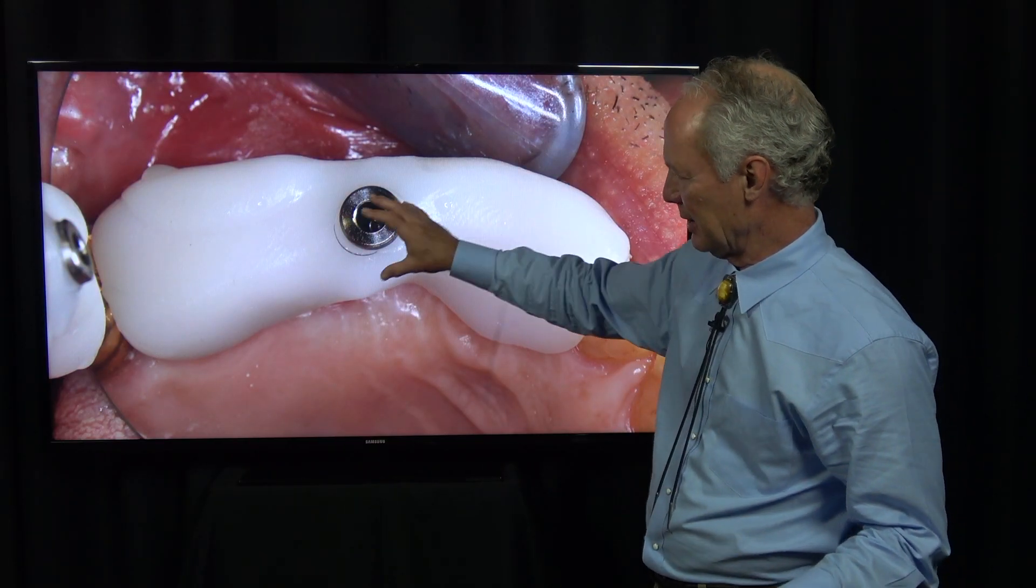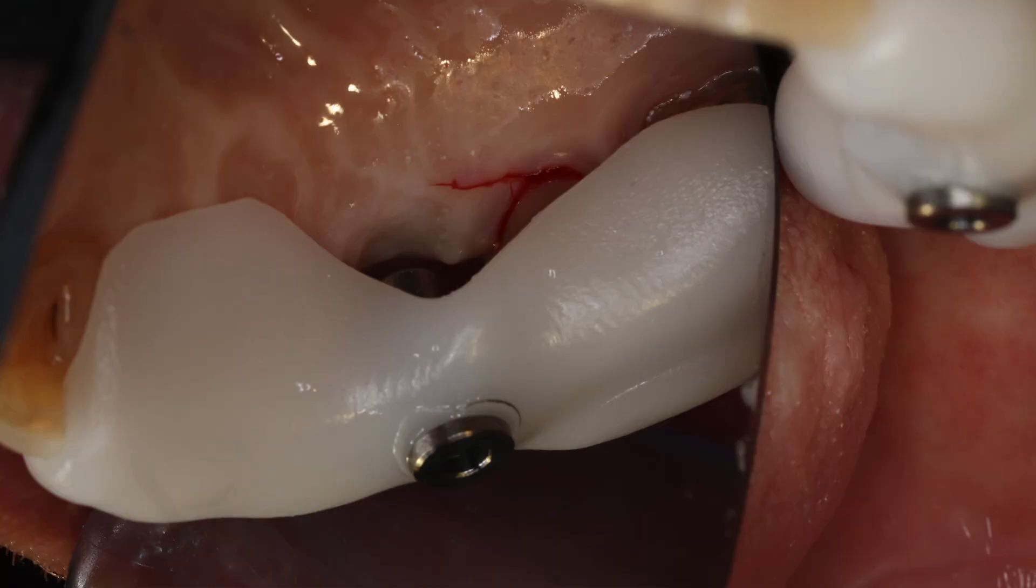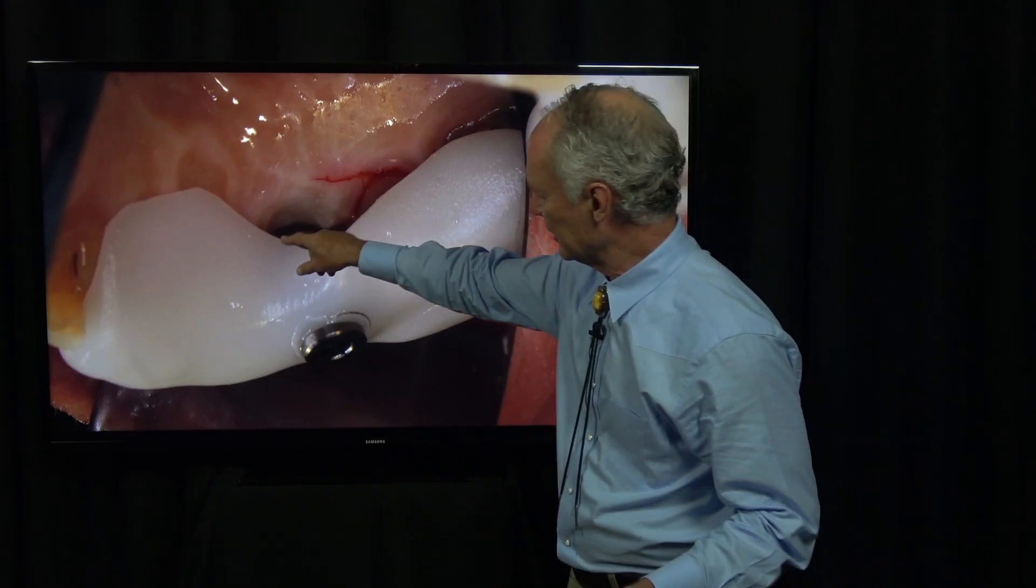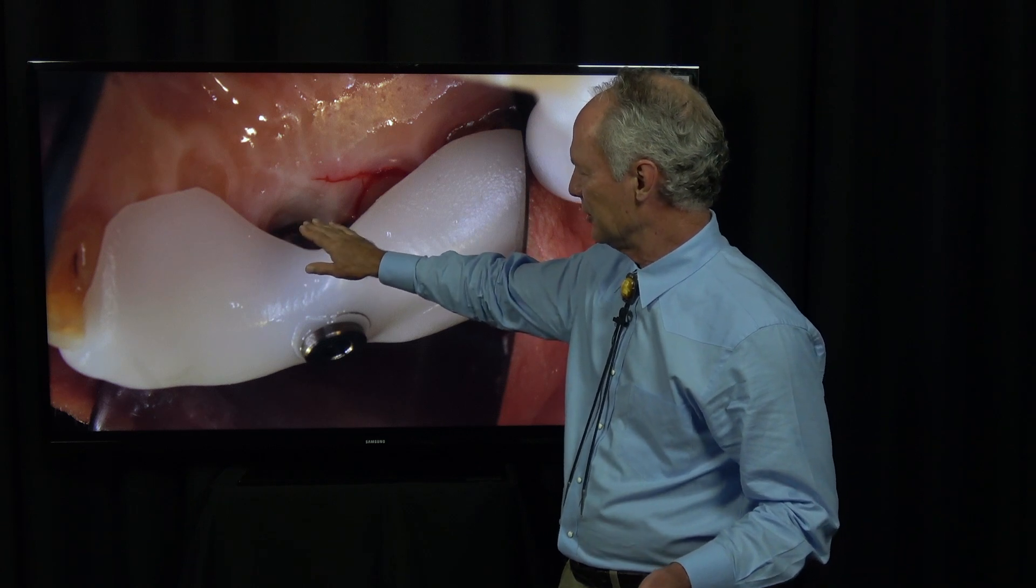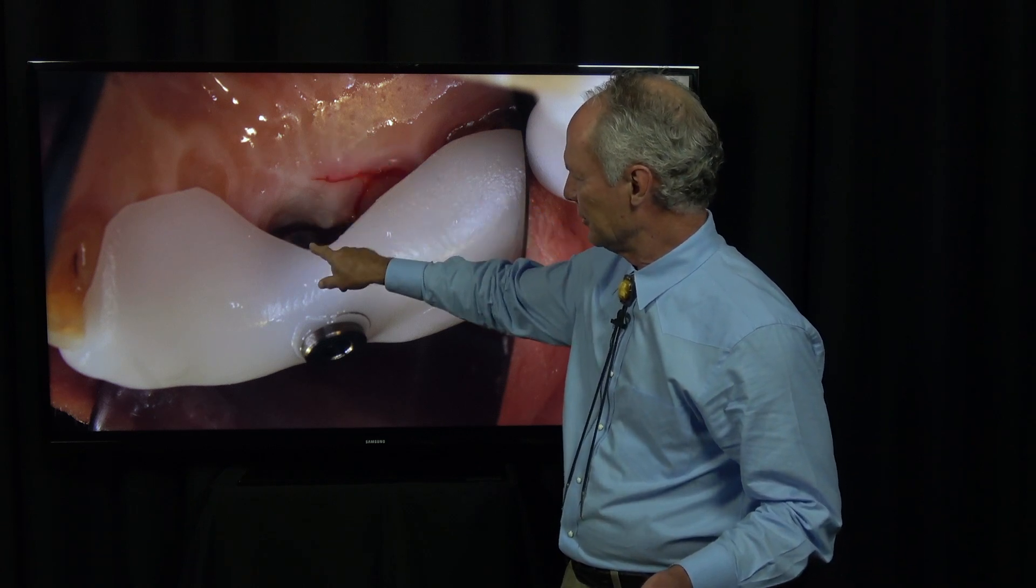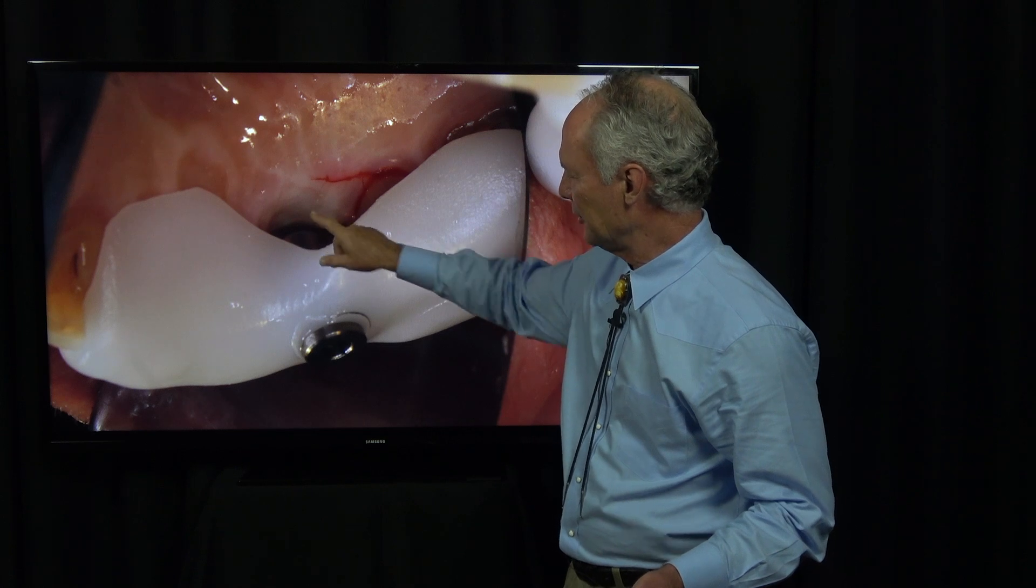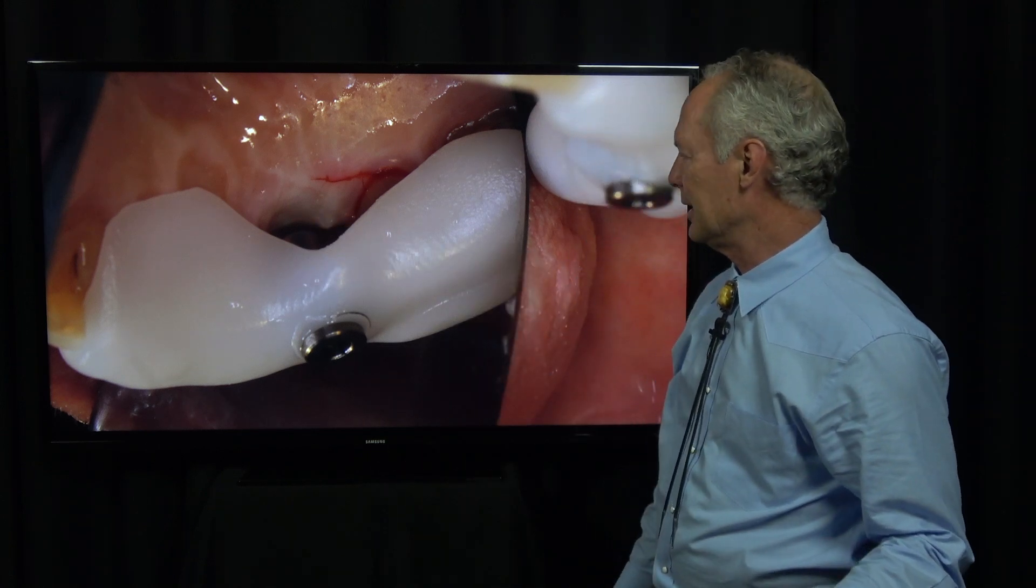This fits perfectly in the mouth. The nice thing is, you don't want this all the way down—you can go down to the tissue because you're going to reflect it. You want this as close to the tissue as possible.